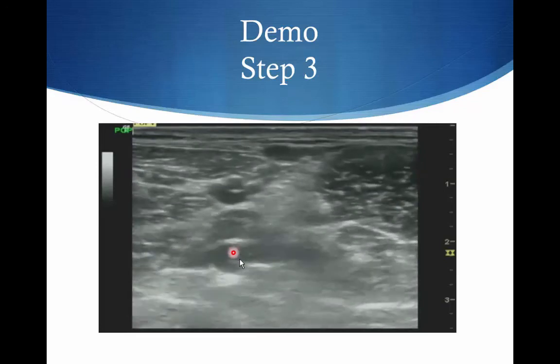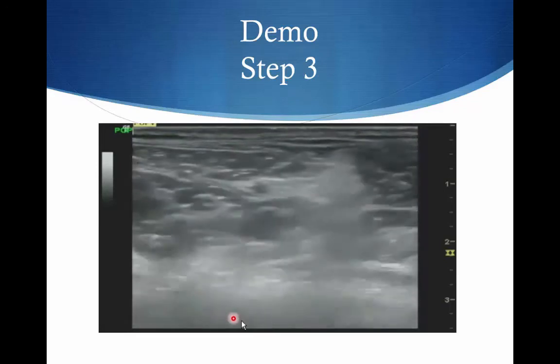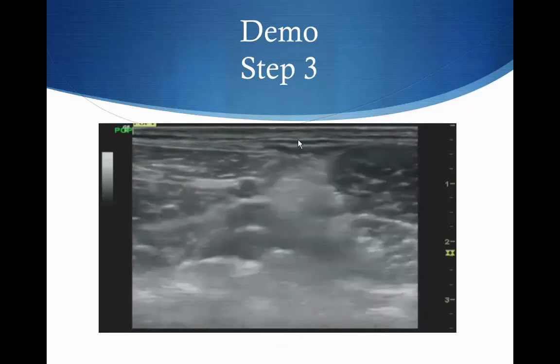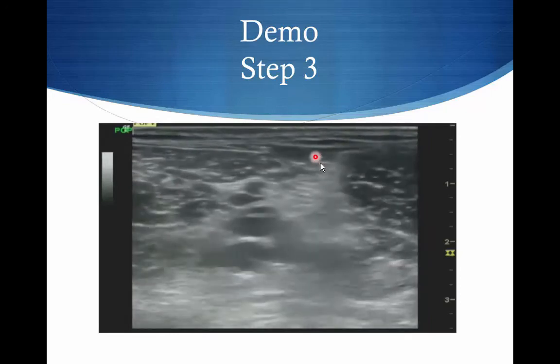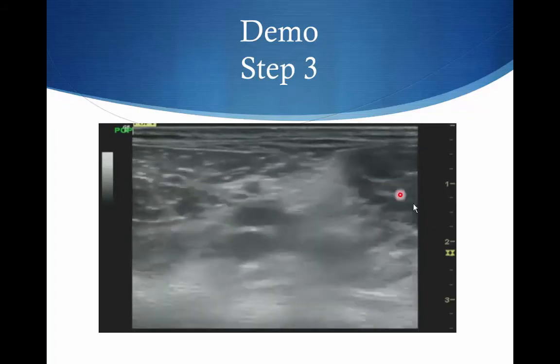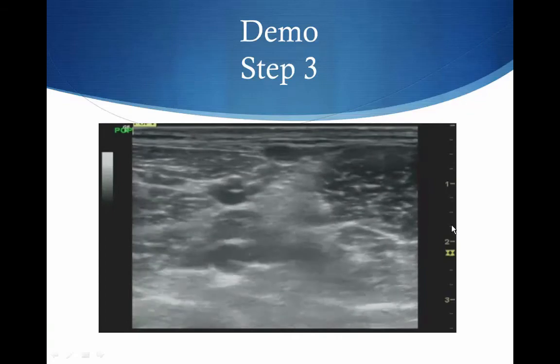So here's our popliteal artery. Vein is on top. We can see as we compress, bone and shadow comes into view, so we know we're deep enough, or it's a clue that we're deep enough. Superficial veins here that compress, which is good. I don't care about those though. Don't let those distract you from the real veins. And then there's tibial nerve. But this vein, it compresses and the artery doesn't, so it's nice and normal.